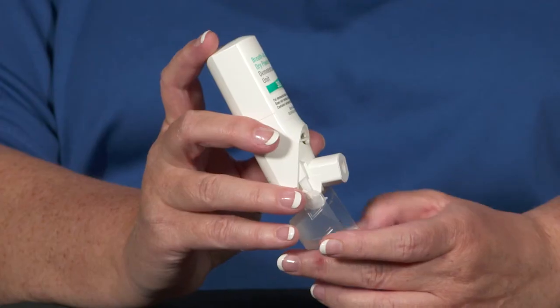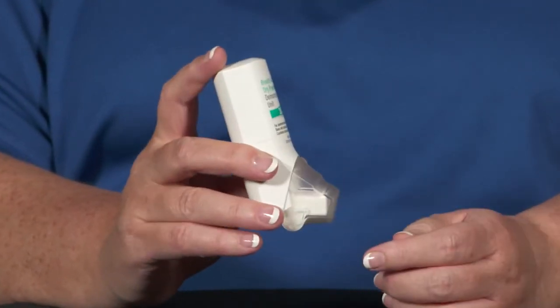Close the cover and make sure you hear a click so you know it's closed like this. If your instructions say to take another puff, open the cap and do everything again like you did before.